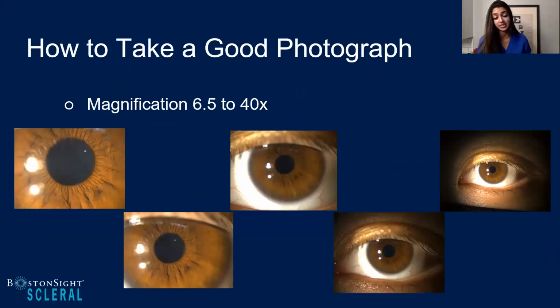I agree with you. I think practice makes perfect, continuing to practice some of these skills. Magnification also plays such a huge role. I think as providers, we're so honed in on the details that, as you mentioned earlier, what I personally like to do when I'm evaluating a scleral lens, especially for a patient that's coming back for follow-up, is crank my magnification all the way low. I want to look at the big picture first and then hone in on the details.